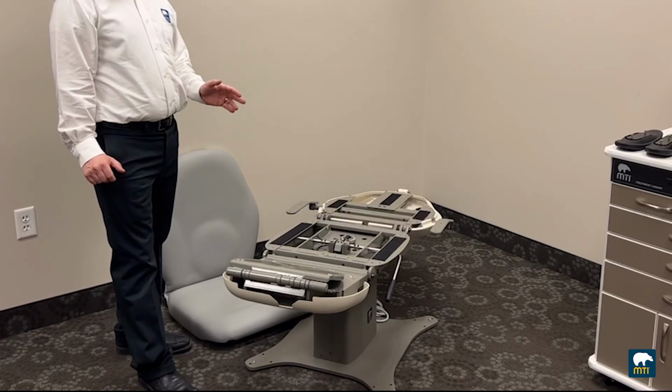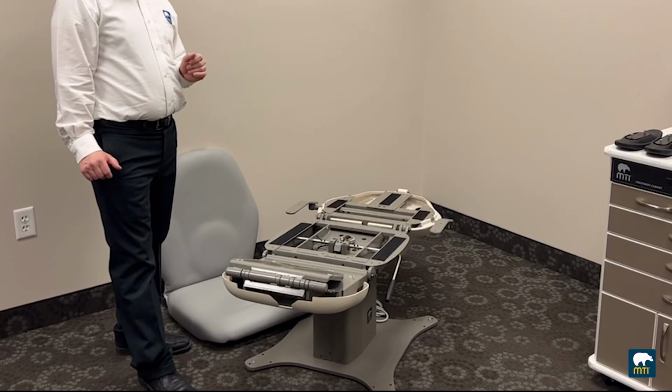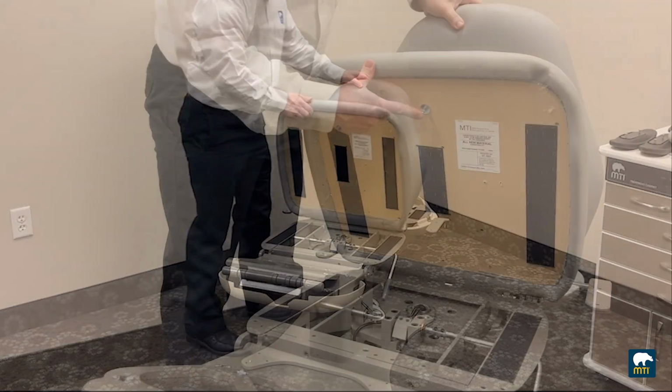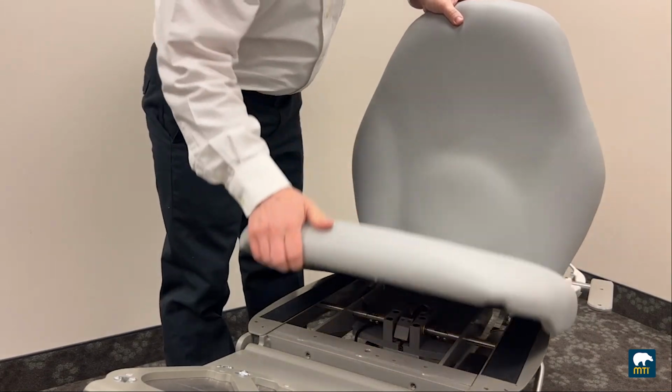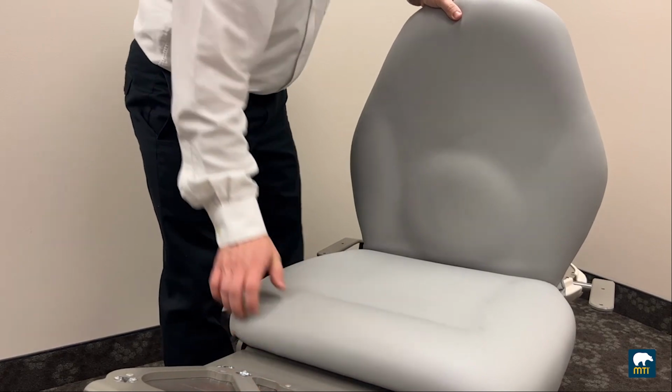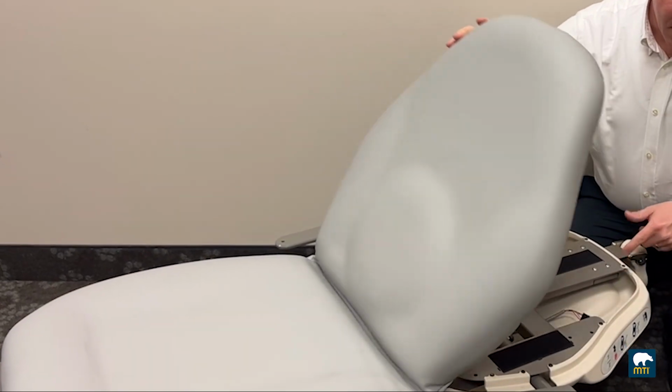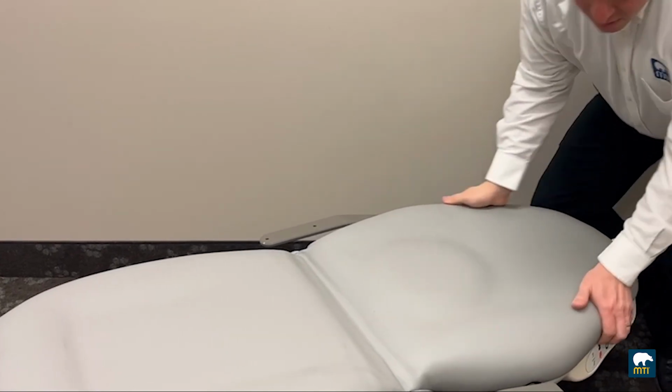To install the upholstery, make sure the chair is laid out flat and grab the seat and back section. First, put down the seat section and line up the front locating pin with the front hole in the seat section, and firmly press down on the seat to attach the Velcro. Next, line up the upholstered backrest with the seat back of the chair and press down firmly.